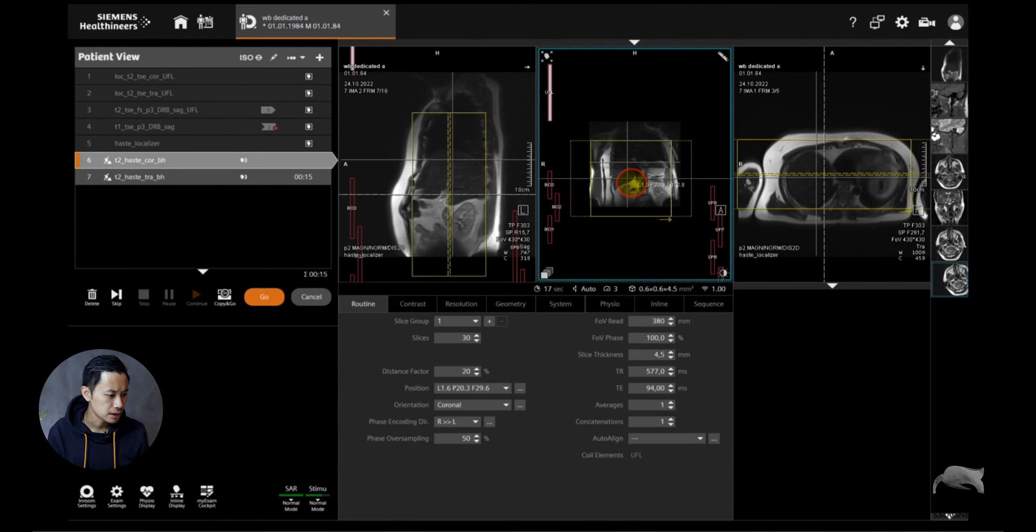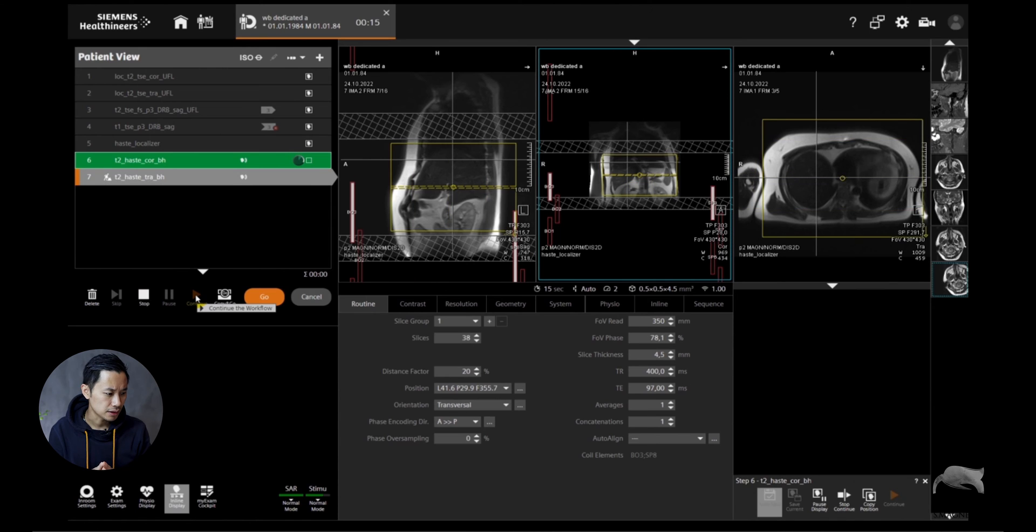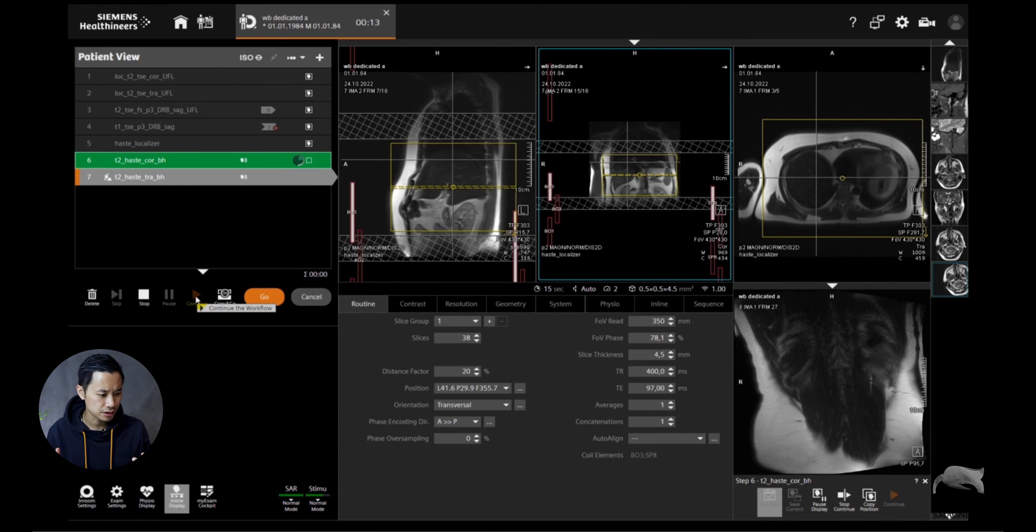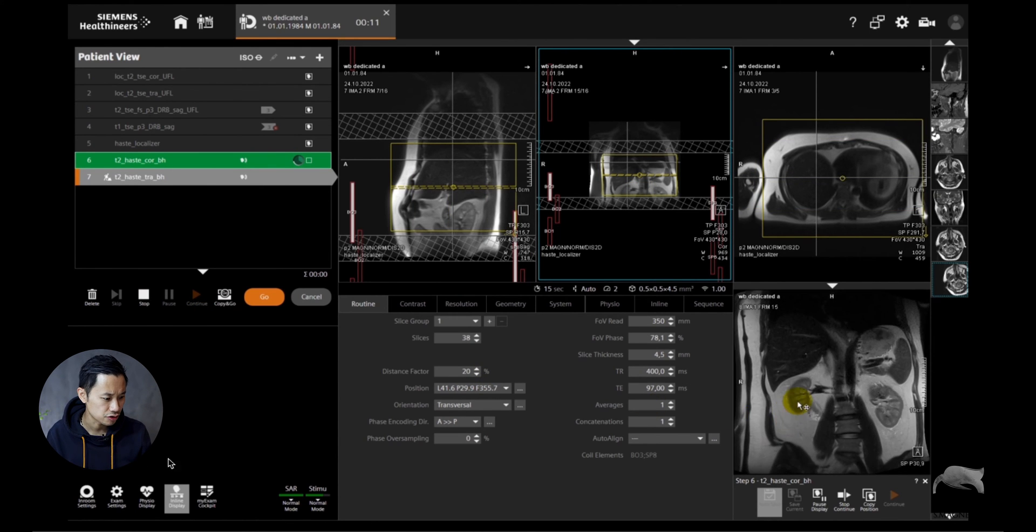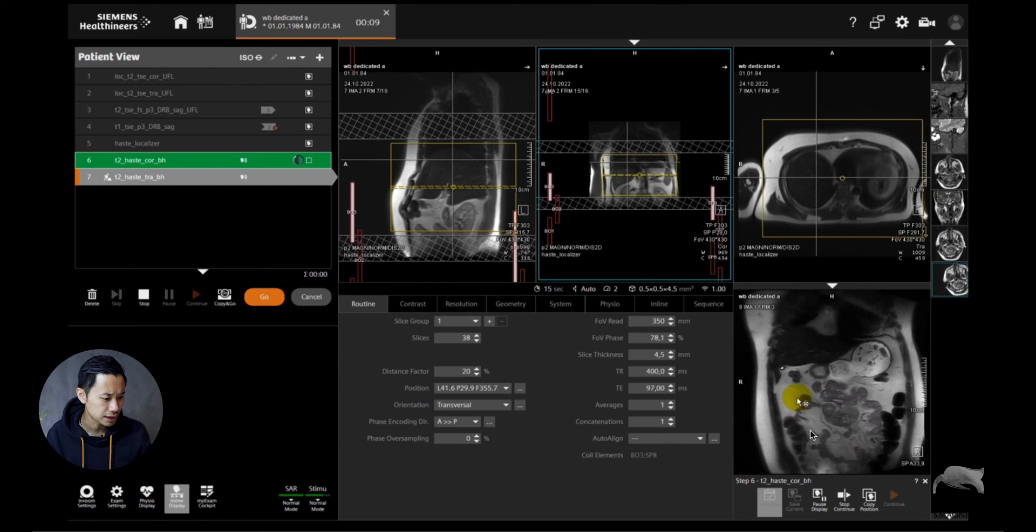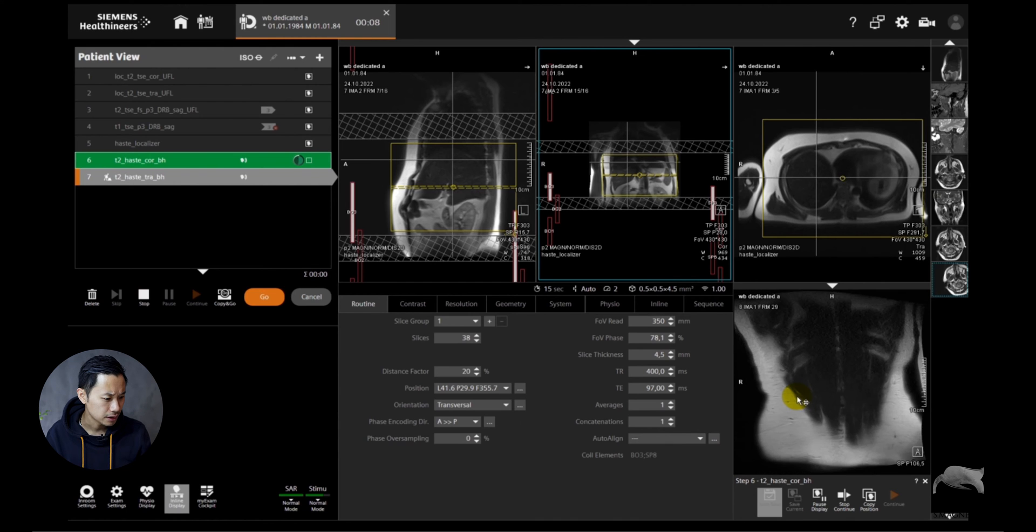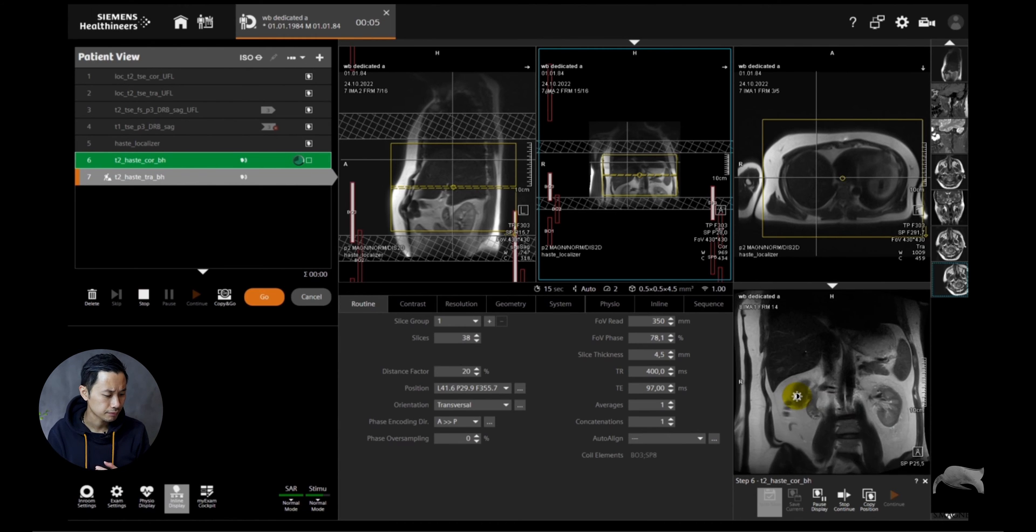I just did two HASTE sequences in coronal and transversal here just to get some images and show you guys. You can see the coronal here, it's not that bad. And then I also did a transversal HASTE.